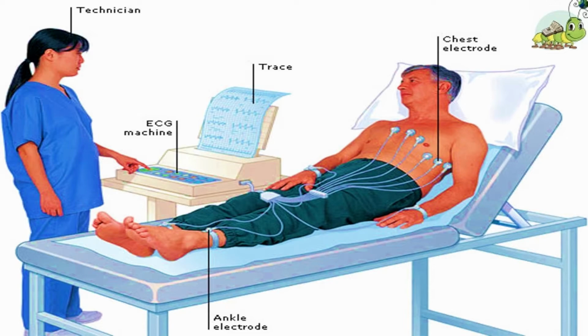Careful analysis of the ECG reveals a detailed picture of both normal and abnormal heart function and is an indispensable clinical diagnostic tool. EKG reflects the overall spread of electrical activity during the cardiac cycle and is measurable because the electrical activity of many of the cells is synchronized during the cycle.